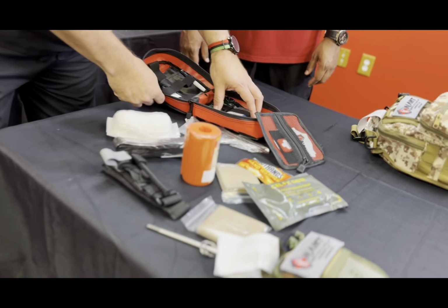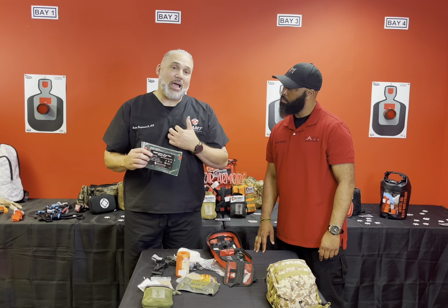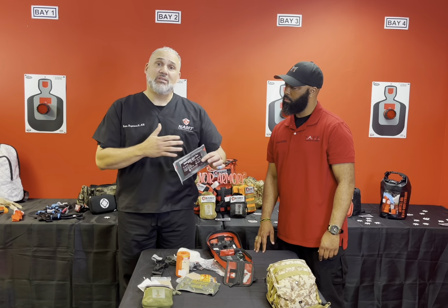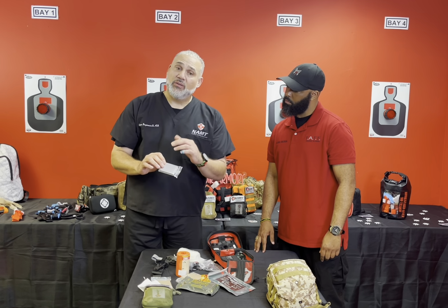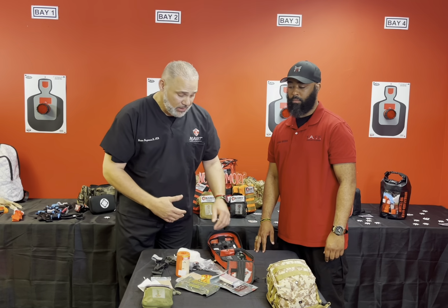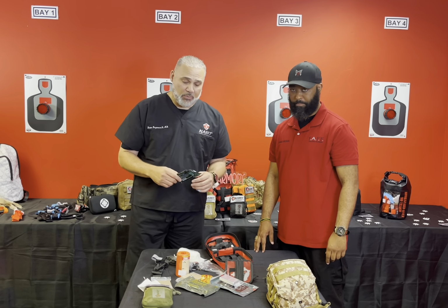In the Crumpler, you're also going to get chest seals, okay? So for occlusive dressings, remember we talked about not packing the box. In the box, from the neck to the abdomen, we're going to use chest seals to cover up any gunshot wounds or penetrating wounds. Here's your Mylar blanket, very good to prevent hypothermia. Hypothermia will kill even in heat, okay? I know that doesn't sound appropriate, but it is. If you lose blood volume, you're going to be hypothermic.